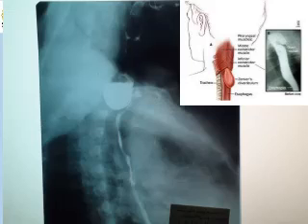Now we will have this radiology, which is called Zenker diverticulum. This is an esophageal diverticulum which arises from the upper end of the esophagus, where this is the middle constrictor and inferior constrictor muscles of the pharynx, and this small muscle is a circular muscle at the esophageal inlet. It's called cricopharyngeus muscle. This triangle is called the triangle of dehiscence, and this is the weakest part in the esophageal muscle layer, and the esophageal diverticulum arises from this area.